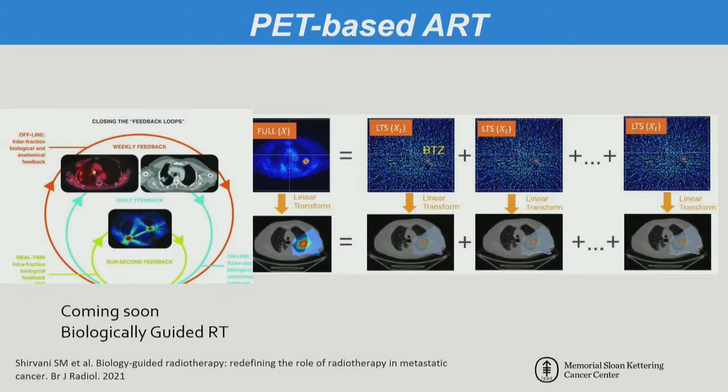And then PET-based, it's there. The LINAC portion is there. The PET portion is coming soon. And I think with this, it's biologically guided radiotherapy. A big area to explore, and I think we will learn a lot on this new line of research and clinic.